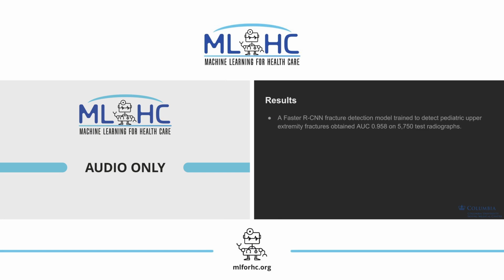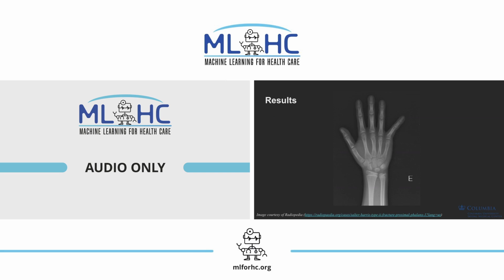Our results. We found that a Faster R-CNN fracture detection model trained to detect pediatric upper extremity fractures obtained an AUC of 0.958 over 5,750 test radiographs. We constructed an interactive web interface that allows interested researchers to easily interrogate this model. Let me show you what this interface can look like in practice.